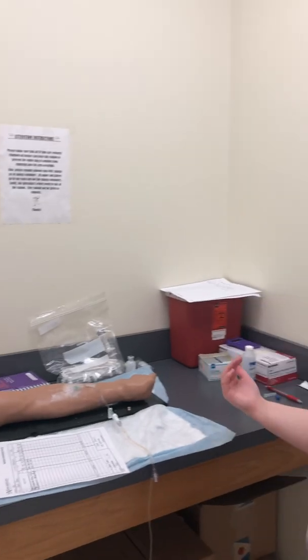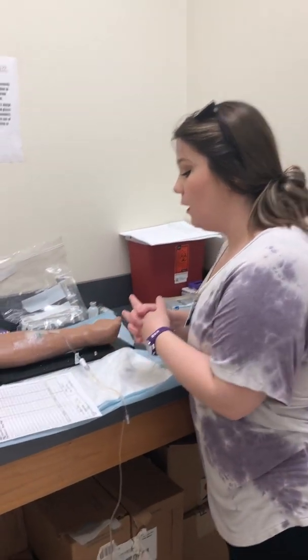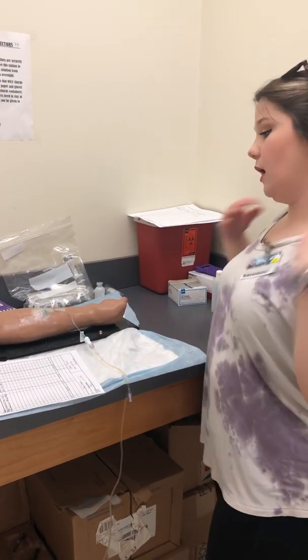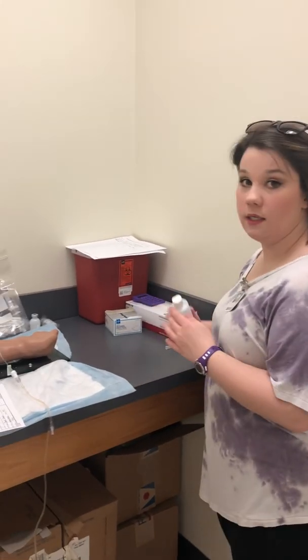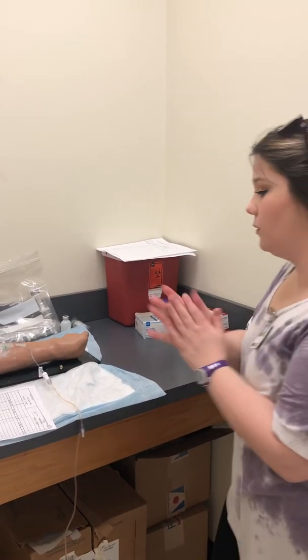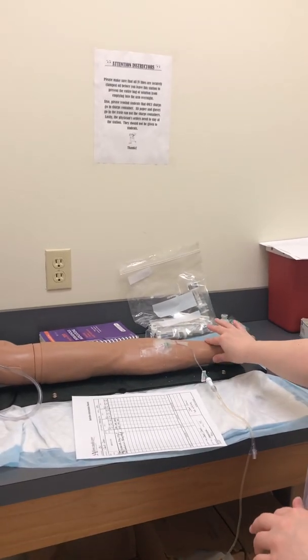I'm gonna go document. Make sure the patient's tolerating it well. Are you feeling okay? Do you have any dizziness? Okay. All right, I'll be back to check on you. Make sure the bed's lowered, and then I will come back, wash my hands again, and make sure the patient's doing well. Monitor the site. Okay, make sure I have the right patient.